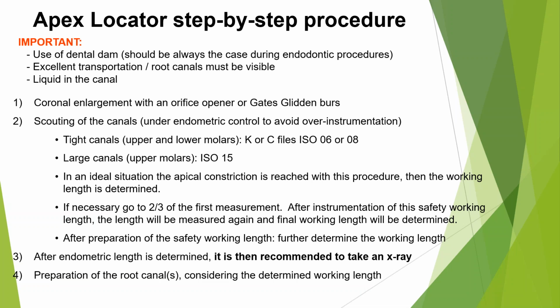There's a lot of old Root ZX out there. You heard Gray talk about how that thing bounces around. So again, this is something you're going to get questions about, so knowing it frontwards and backwards and being able to troubleshoot it are all things that are going to help you sell more of these, service them in the field, and take care of your customers. All right, that's it for me. Any other questions or comments?